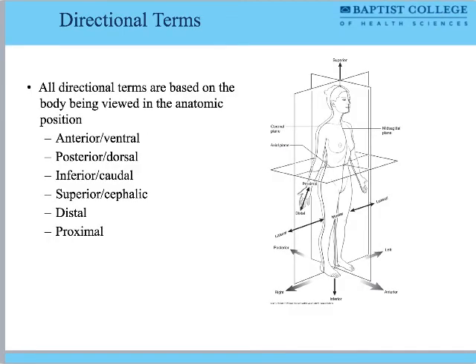Regardless, though, it's still helpful to have some waypoint and directional terms. So we will use the exact same directional terms that we've used in sectional anatomy, et cetera. I'll be constantly reminding you to refer back to how the patient's body is on the image.